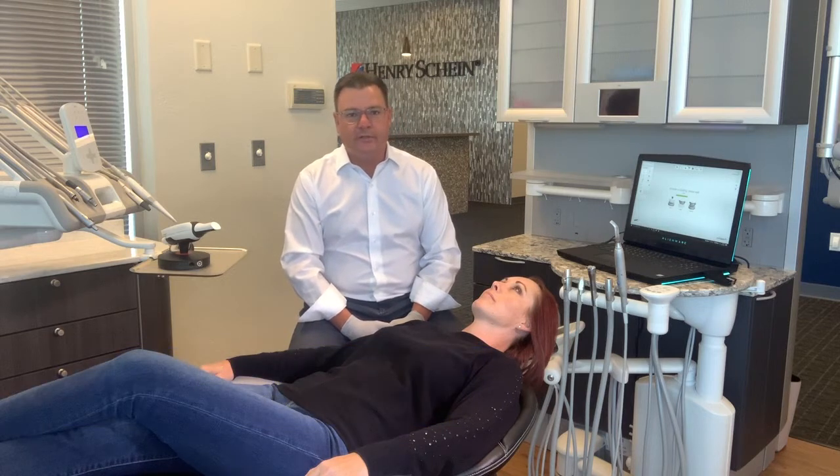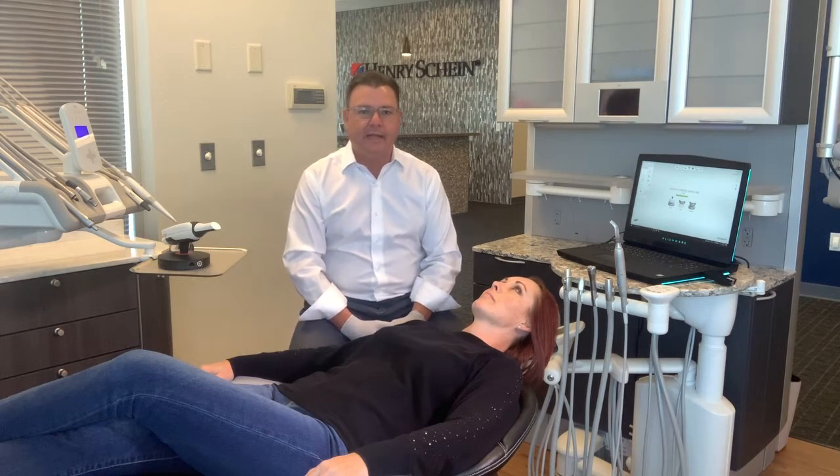Hello, everybody. My name is Matt Kunzler. I work with Henry Schein Dental. I'm a digital workflow specialist, and today's video is going to be highlighting the TRIOS 4 intraoral scanner.